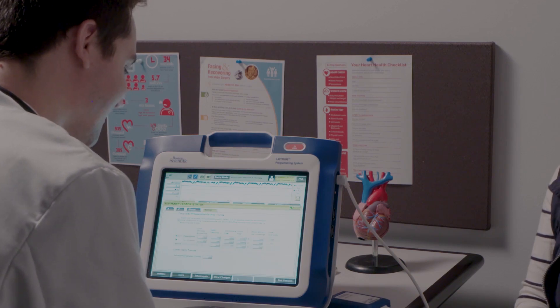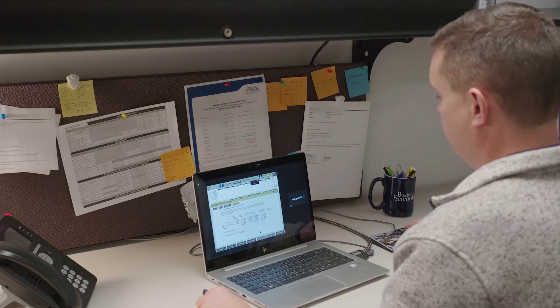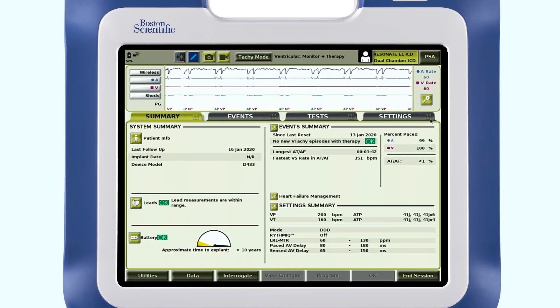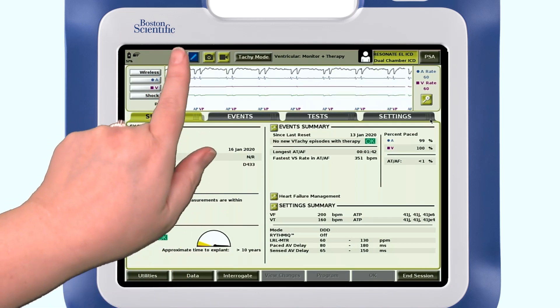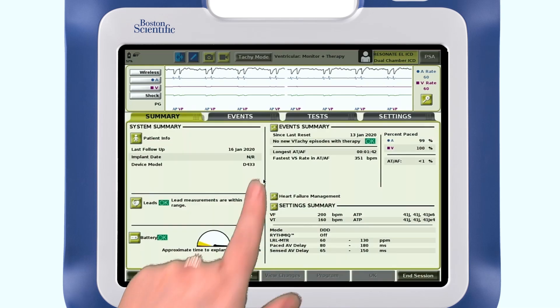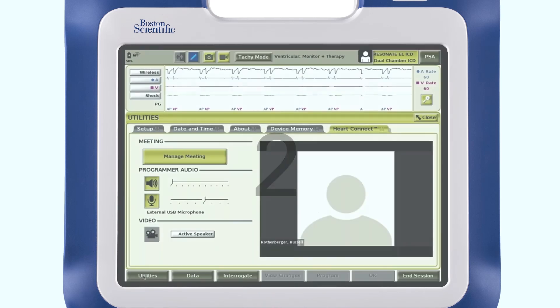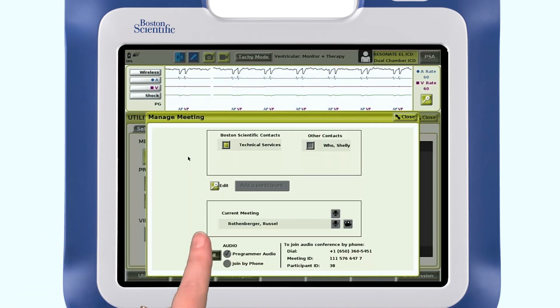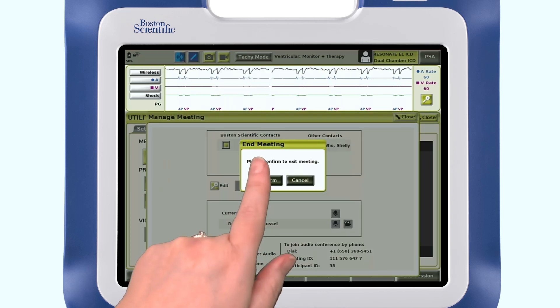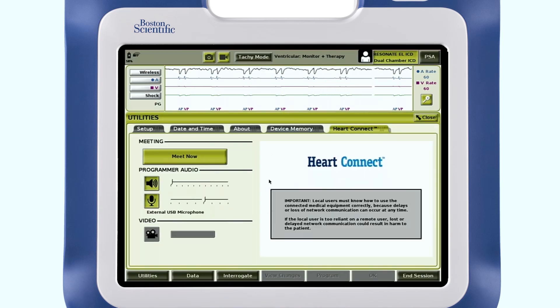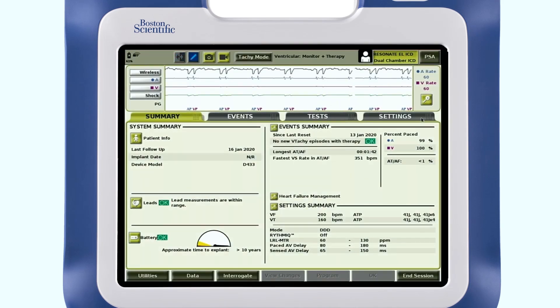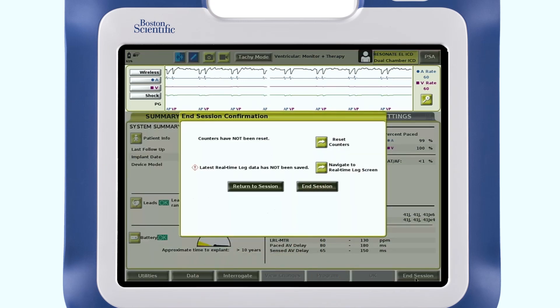Great. Thank you for your assistance. Once the call is complete, there are three ways to end a HeartConnect online meeting. 1. Press the Meeting in Progress blue blinking arrows button, and press Confirm. 2. From the HeartConnect main screen, press the Manage Meeting button, click the End Call button, then press Confirm. 3. If you are sharing your screen during a patient session, press the End Session button, then press End Session in the confirmation.